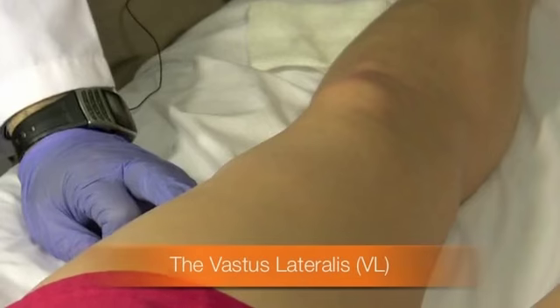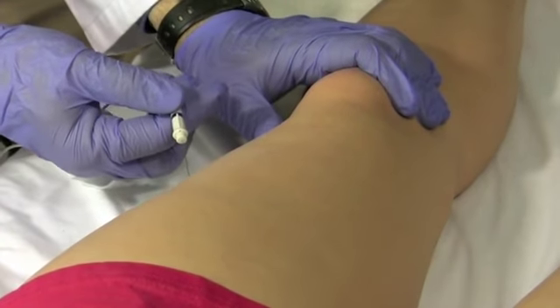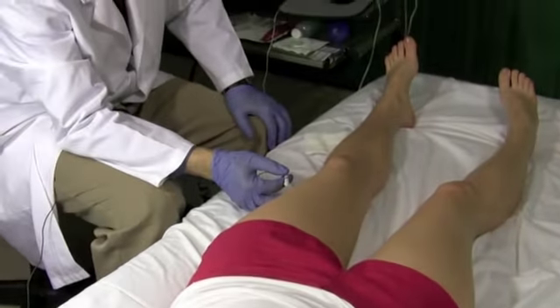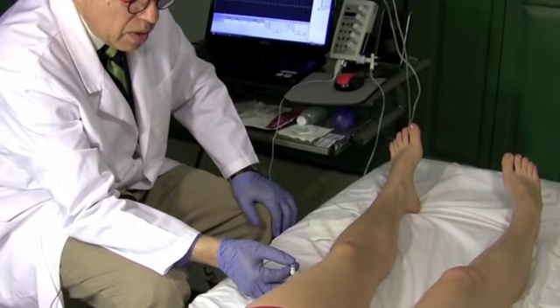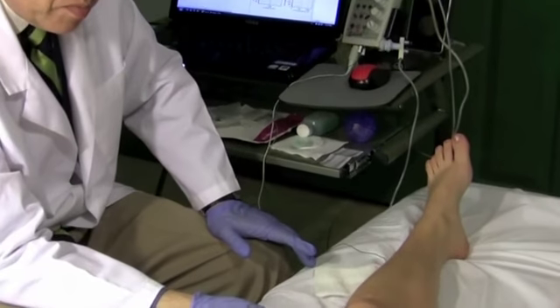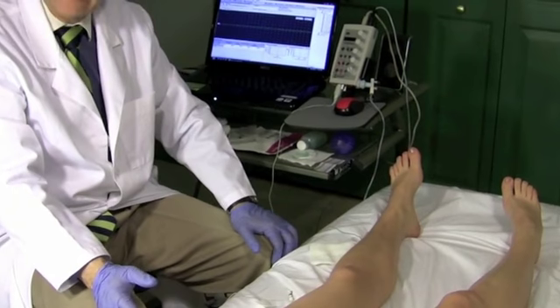The next muscle is going to be the vastus lateralis, part of the quadriceps. And here we insert it right here, stick. Okay. And let's see it again. Again, insertional activity. Here we go. Insertion, and it stops. Insertion, and it stops. And that was the insertional activity.